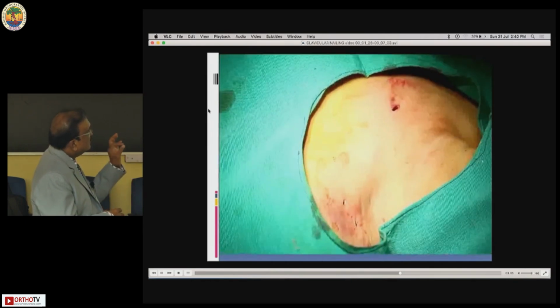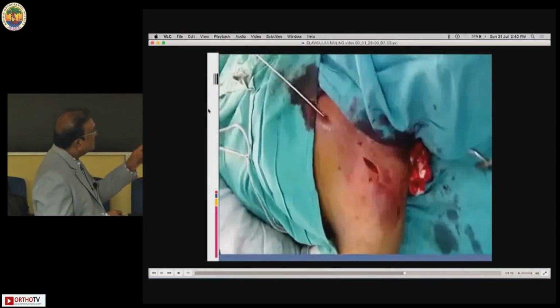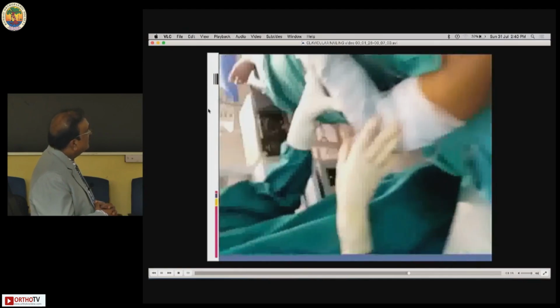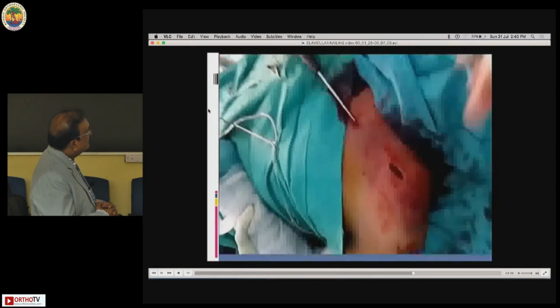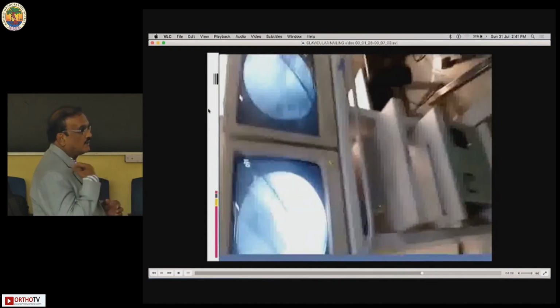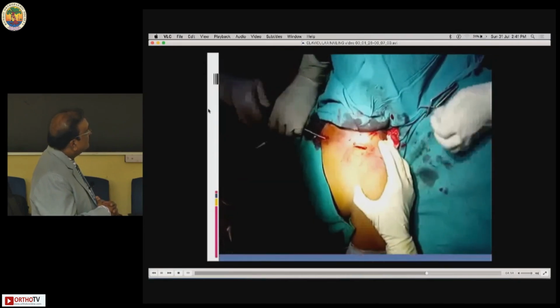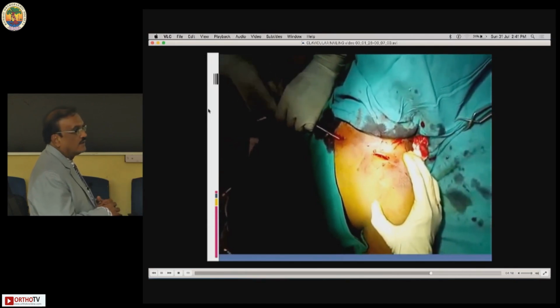And you can see this is the small incision. This is very small. Suppose you are not able to negotiate, give a very small incision, reduce the fracture, and then you can also negotiate. Usually the nail ends about 1 centimeter short of the acromioclavicular joint. So you can see you can compress the fracture site.